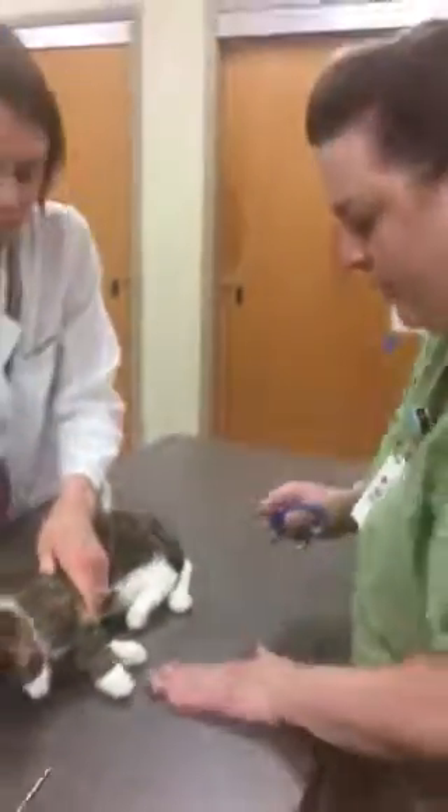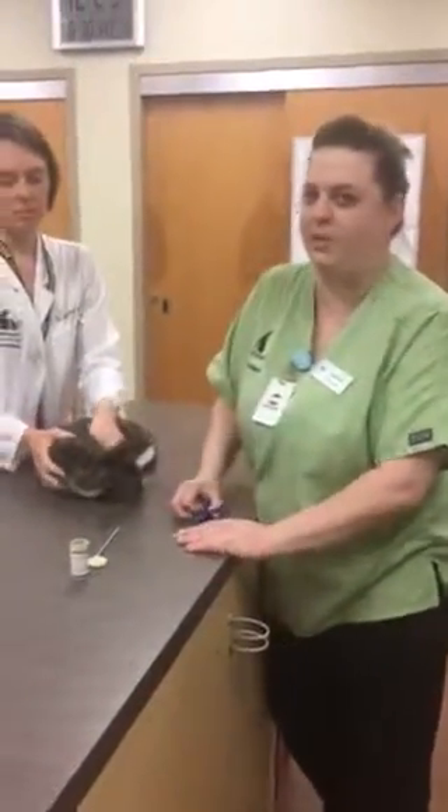Now I didn't see any bleeders. We didn't need our quick stop, but it's available in case we need it. So this pet's ready to go back to its owner.